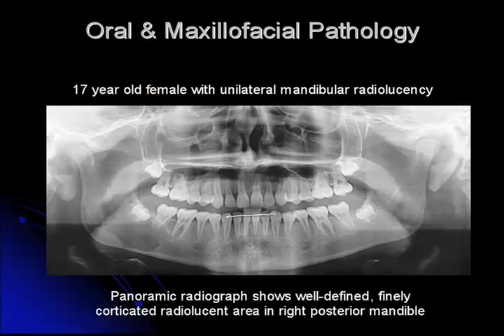So this is the approach in medicine, and it should be a very similar approach as the FDA and the American Board of Oral Maxillofacial Radiology suggest for dentistry, and that is their recommendation, that you don't just take x-rays to look for things that can be there, but once you've taken them, it's very important or incumbent upon you to evaluate them and look for anything on them. So we don't just look at the area of the implant and trace the nerve and say, okay, this is all we're looking at. There's a whole volume and there's other information in areas that we need to look at. And so this becomes very important. So we don't take images for occult disease, but once the image is taken, we need to look for it.